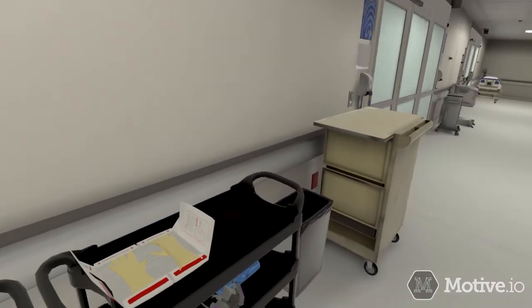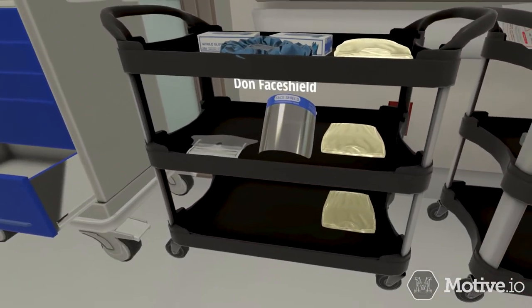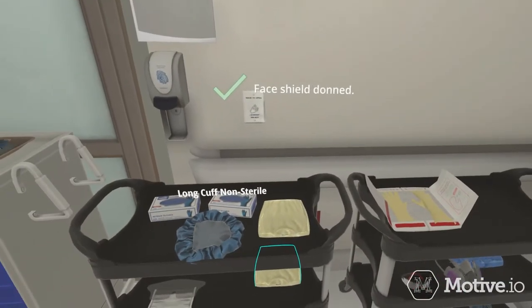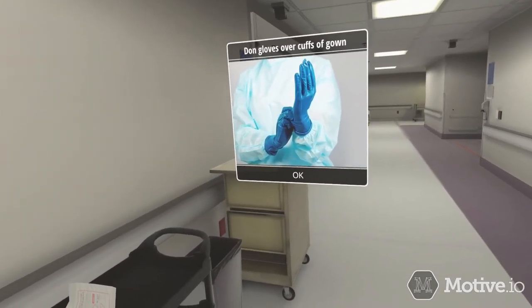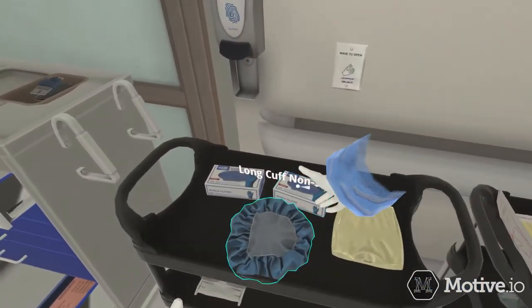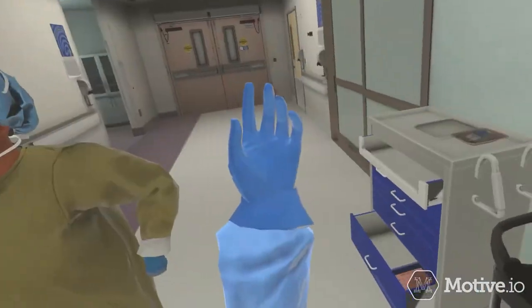The next step is to don the face shield. Then choose the best available option for gloves. Gloves should cover the wrists of the gown. Your first choice should be long cuff non-sterile gloves; your second choice would be regular cuff non-sterile gloves.